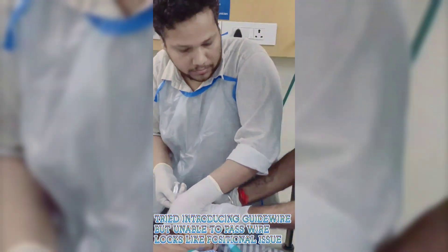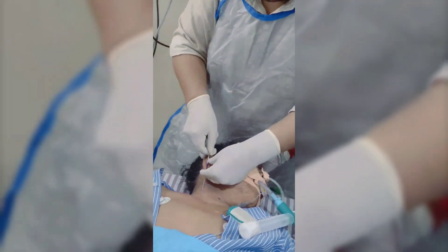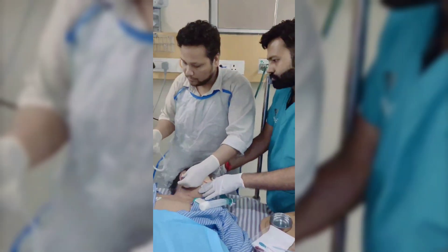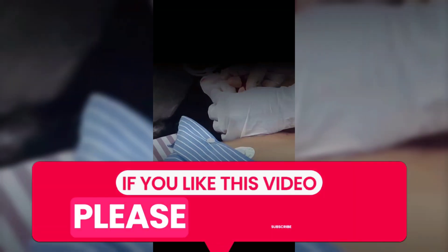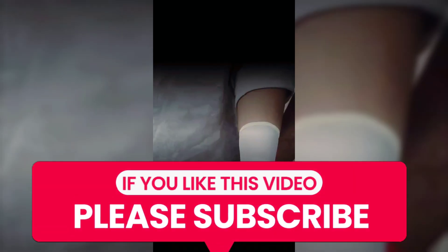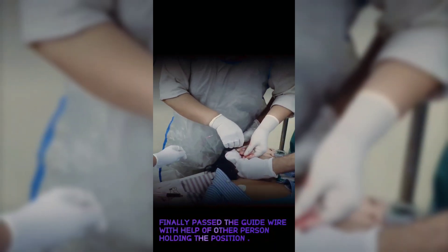Attempted to introduce the guidewire but unable to pass — looks like a positional issue. A second prick was taken as an attempt to pass the guidewire due to positional difficulties. Finally, the guidewire was passed successfully with the help of another person holding the position.